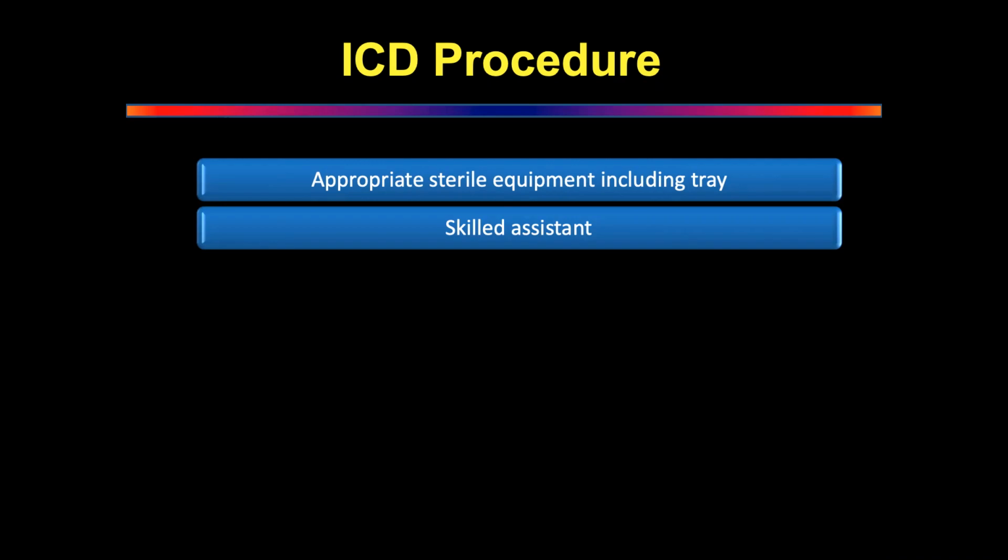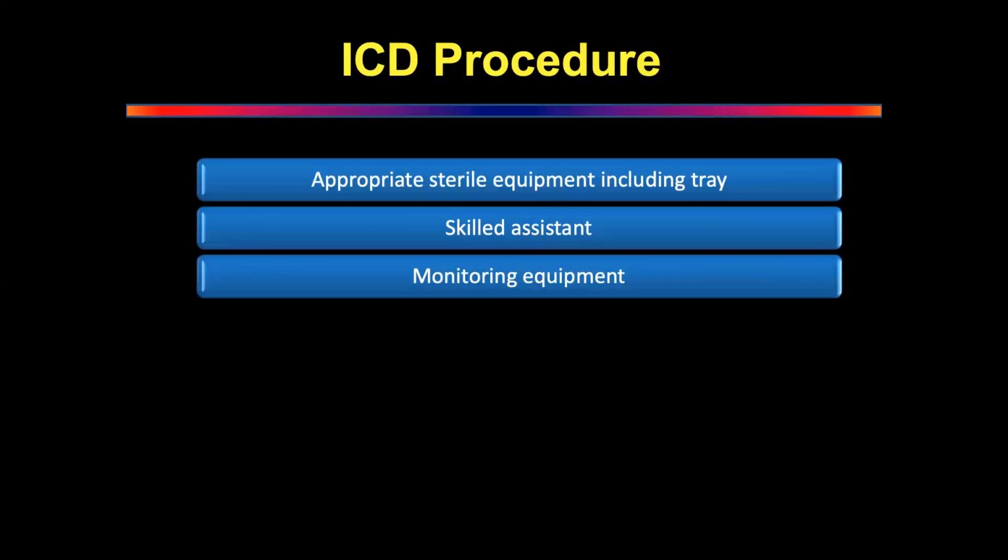Before touching the patient. Say ECG, oxygen. Very good. You need the patient to have monitoring, an IV cannula. Yeah, monitoring equipment. You have to make sure that the monitoring is in place. Okay. What else have you got to make sure? Coagulation profile. Yeah, we're talking about blood tests and investigations.